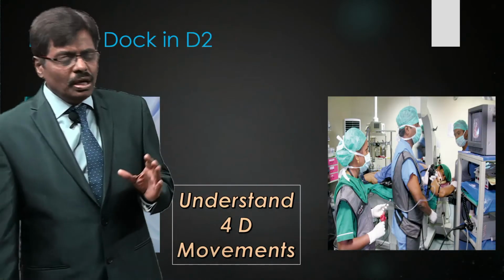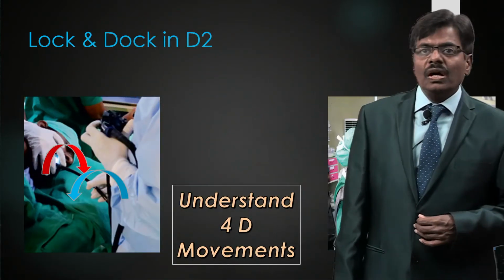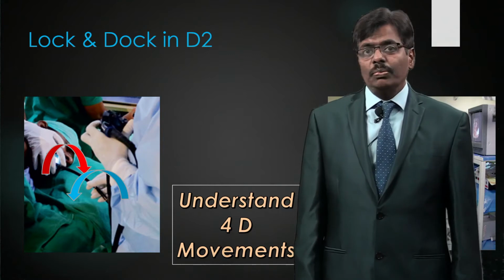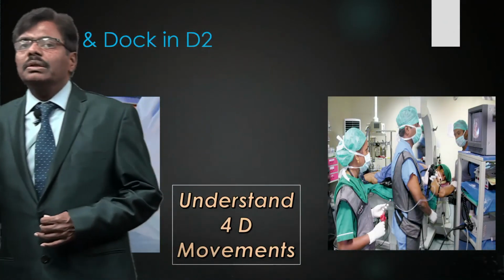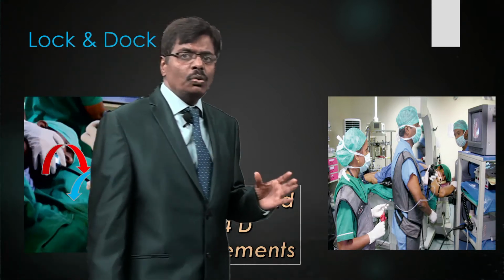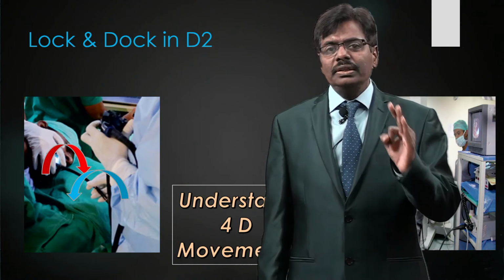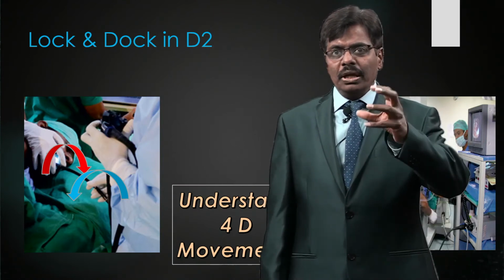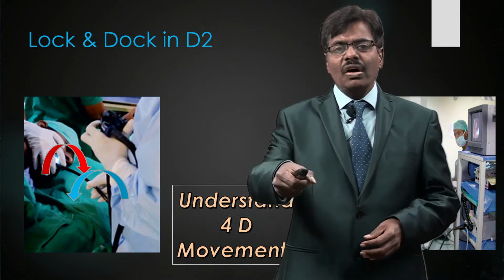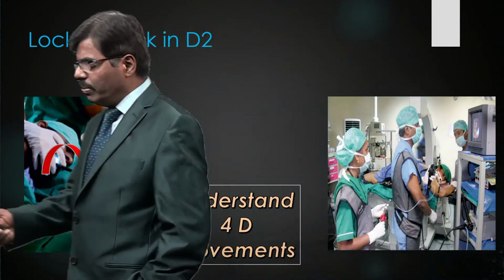And as I said, you need to remain in D2. Like the case you just now saw, about 5 minutes we finish the whole procedure. Sometimes it will be so frustrating, 40 minutes, 50 minutes it might take. So how to stay in D2? That is only if you know these 4 D movements. What do you mean by that? You should know how to control the big wheel, small wheel, suction, and elevator. So these are all what I call the 4D movements. Okay.